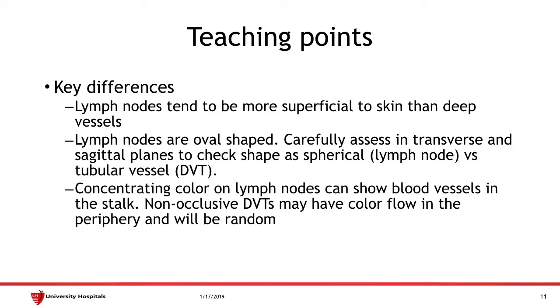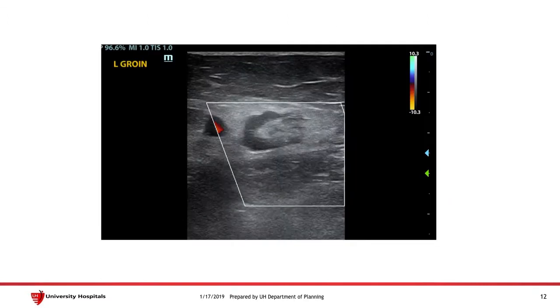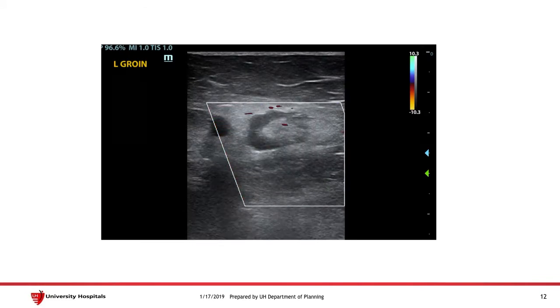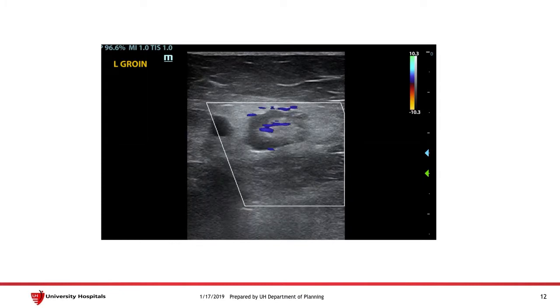The third point is that if you apply color flow on the lymph nodes, this can actually show blood vessels in the stalk. Non-occlusive DVTs, if you directly visualize them, may have color in the periphery but would not have color in the center of the DVT. Here's an ultrasound image that illustrates this point: when you apply color flow through the object, you can see color within the stalk itself, likely representing blood vessels within the lymph node stalk. This would not be seen if this were a DVT.